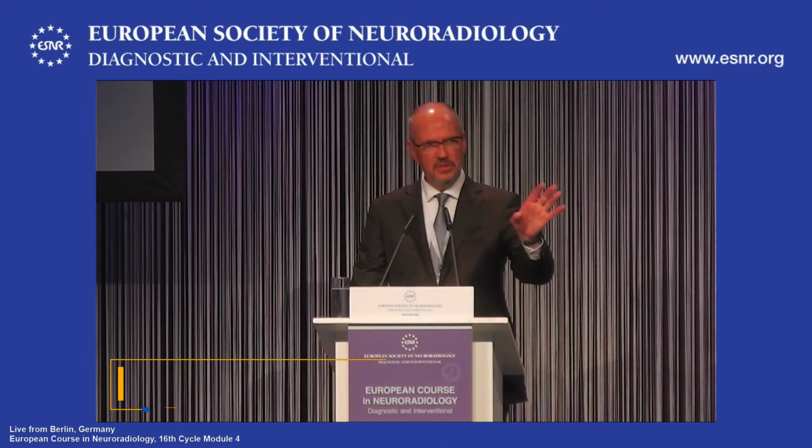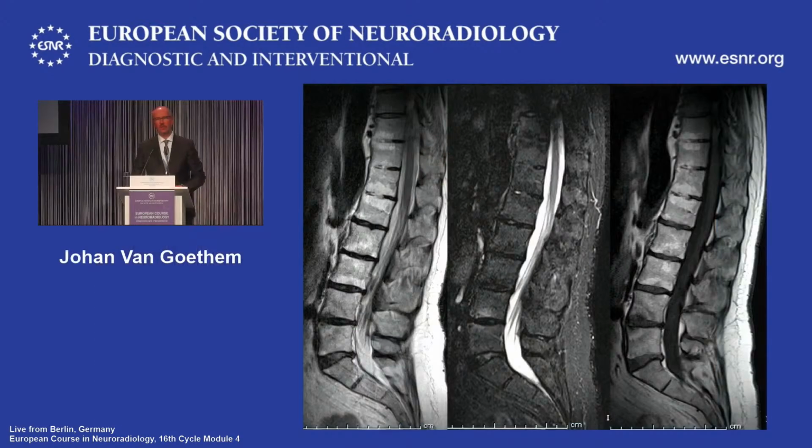I will follow your presentation that you have online, but I have added a few examples which you don't have, don't worry. So if you get an image like this on an elderly patient with low back pain, it should not be too difficult for you to pick up the abnormalities here. We can all see that except for the fact that there's of course multi-segment degenerative disease, even with Modic type 1 changes, this patient also has alterations at the thoracolumbar junction with lipomatous end plate changes and actually ankylosis at many levels.